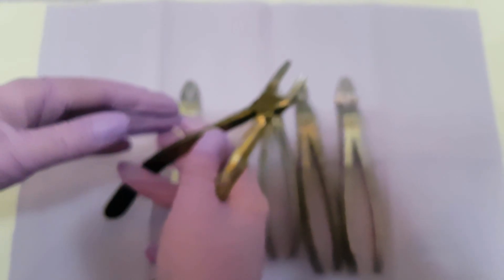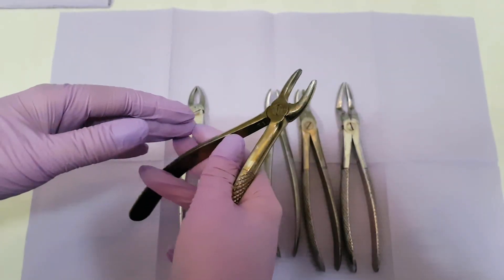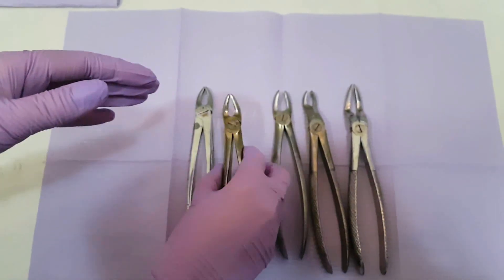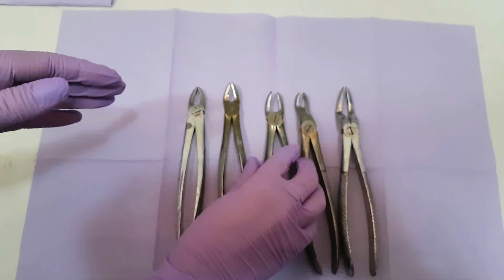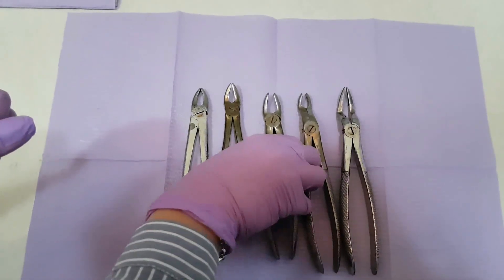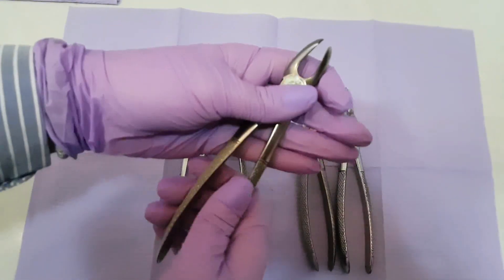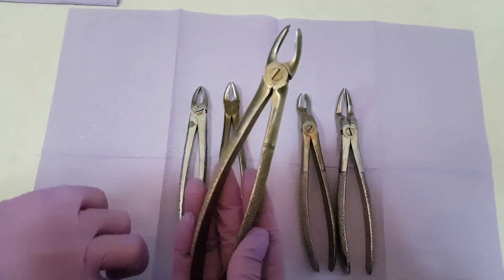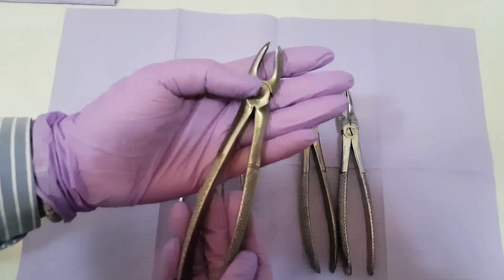This is how we properly open and close this forcep, like all the others. Next we will describe the forceps that is used to extract the first and second molar. These are the working handles, the hinge and the working beaks.